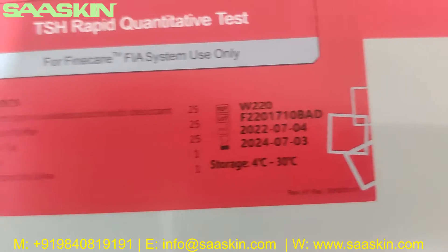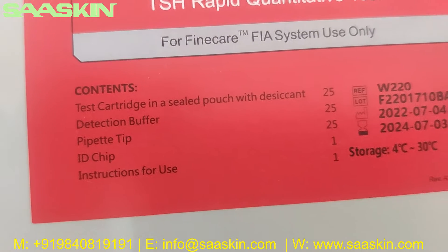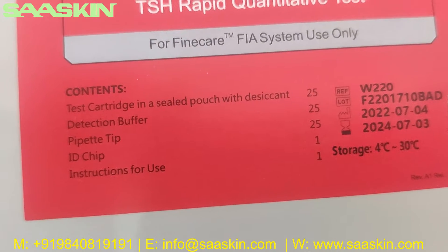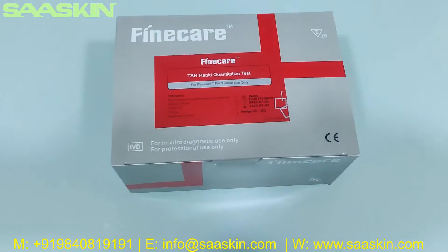You can also see the expiry period, storage temperature conditions, and room temperature conditions. The contents listed on the box include: 25 test cartridges, 25 dilution buffers, 25 pipette tips, 1 ID chip, and an instruction for use manual.